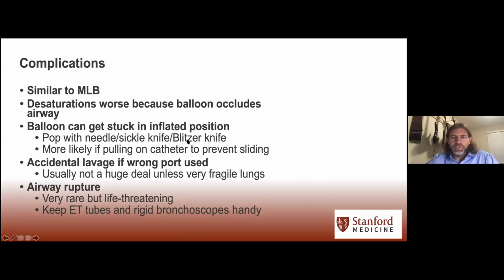And then airway rupture. Again, I told you that I did this, my first experience with Rutter and Cotton. I've seen several airway ruptures with balloons since that time. Fortunately, only a small handful in my own hands. But if you do a balloon dilation, you put the camera back in and you're looking at the beating heart, that tends to be a problem. It's rare, but it can be life-threatening.